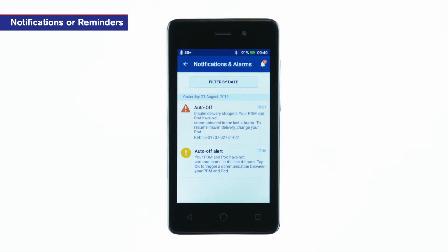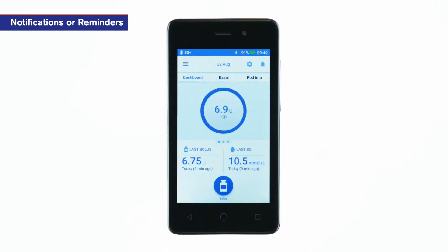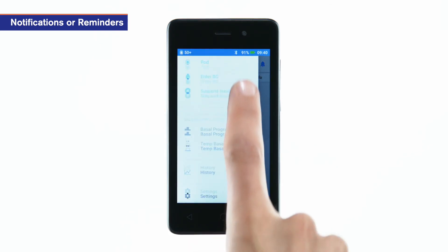You may choose to turn some of these reminders off, depending on your preferences. To customize these notifications, go to the PDM settings, then tap Reminders.